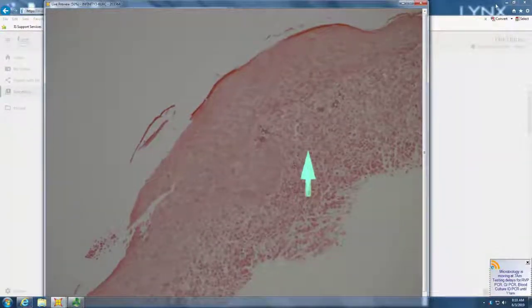Eccentric nucleus, ample cytoplasm. Is that a reniform nucleus? It is. So this is LCH? LCH. Well done, with no hematoxylin. That's like with one eye tied behind your back, right? And yet you did that beautifully.